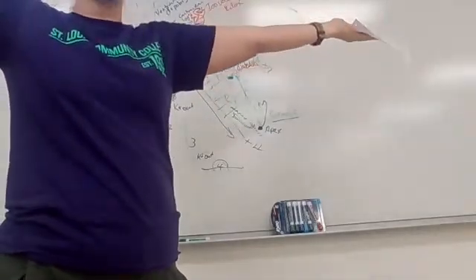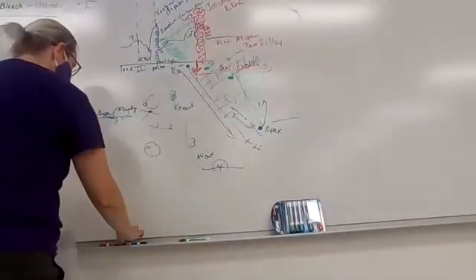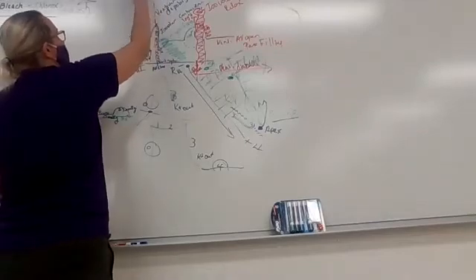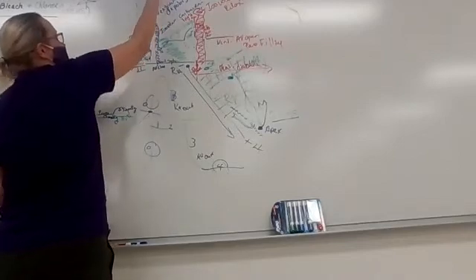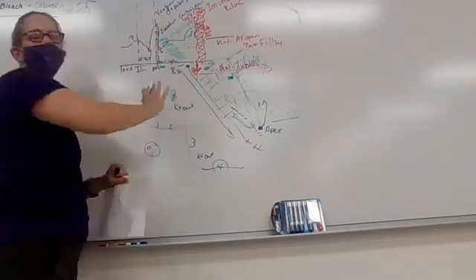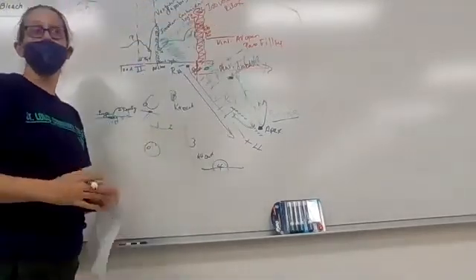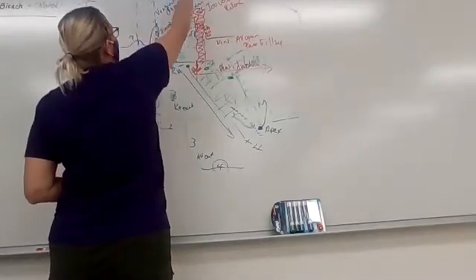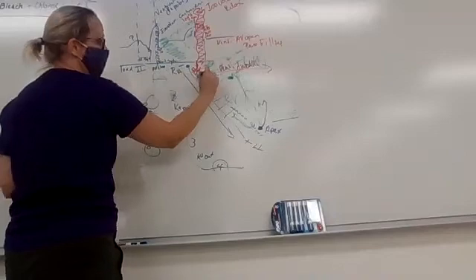Open the AV valves up again and start to let blood come back into the ventricle. Okay? Now, the segments that you need to be aware of. Usually they talk about the P to R segment or interval. That usually is a time where we know that the atria are going through a period of systole and then going into their diastolic period. Okay? And then you usually hear about the QT segment or interval.